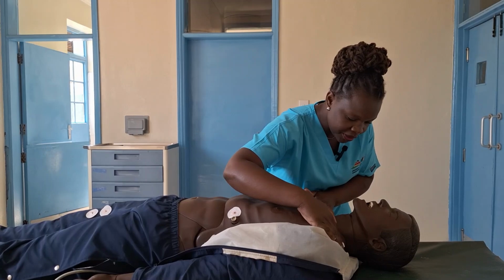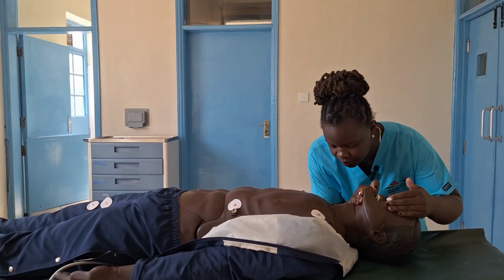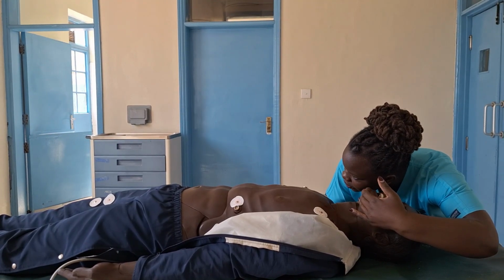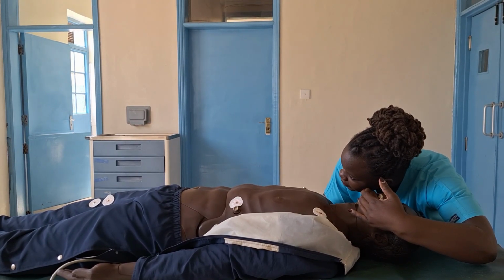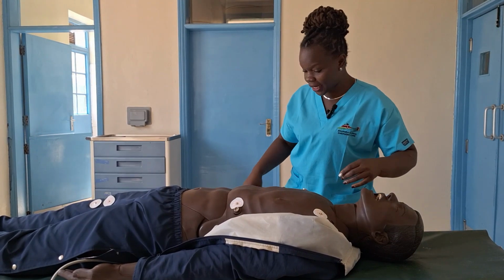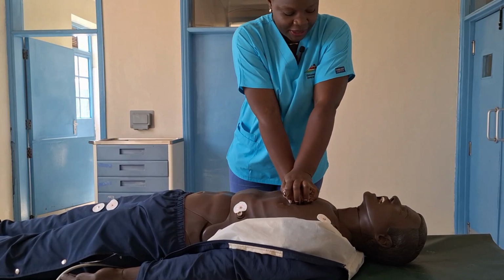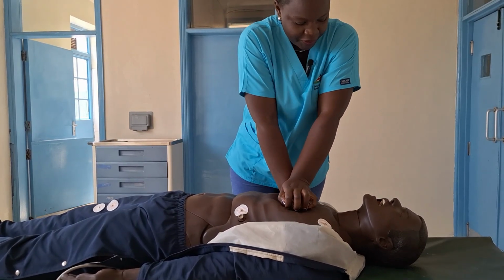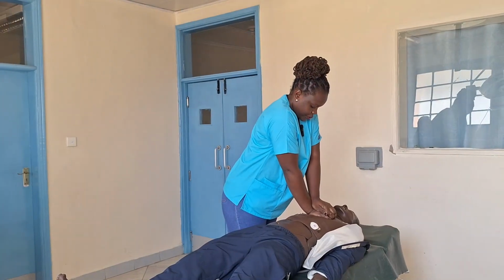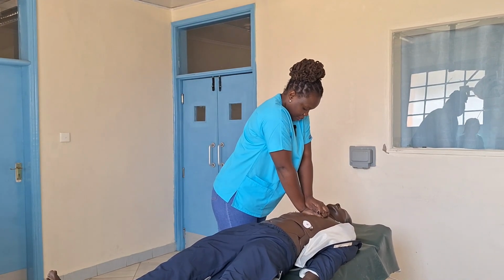John, no response. Help please, patient in cardiac arrest. We need a defibrillator and a BVM mask. I'm starting compressions.